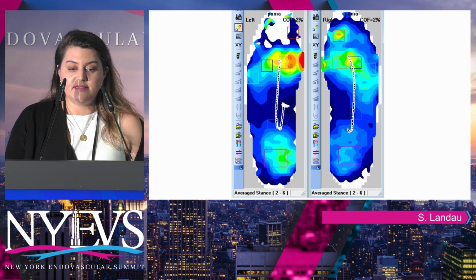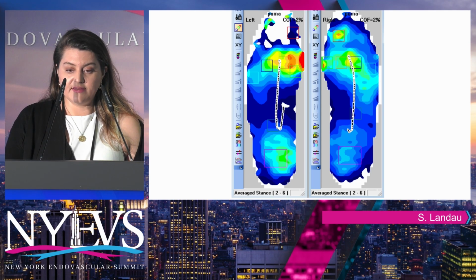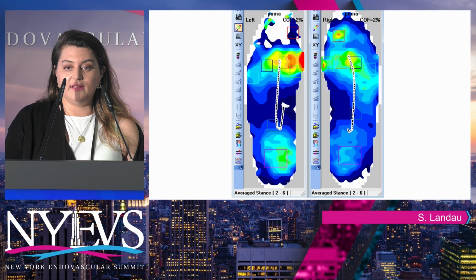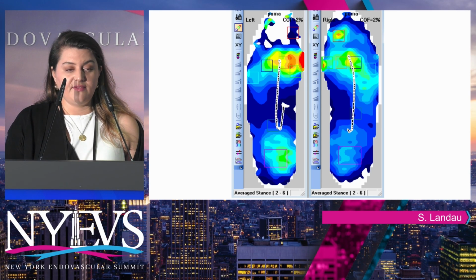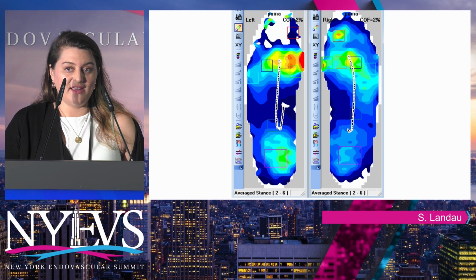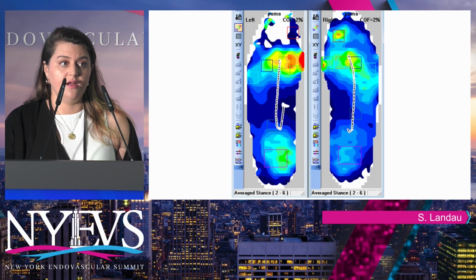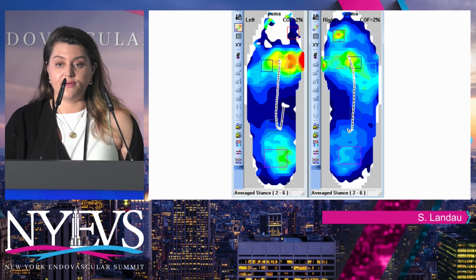So ideally, when someone has digital amputations, that's why a cam boot walker works so well for this, because it's really Perry's triple rocker, right? It has a rearfoot rocker, a forefoot rocker, and it evenly takes away the increased pressure in the forefoot. In fact, if any of you have had a plantar plate rupture ever or injured any of your MPJs, that's why a surgical shoe doesn't feel as comfortable as a cam boot on that side, because a surgical shoe will only reduce forefoot pressure about 25%, but a cam boot will reduce it at least 75%.